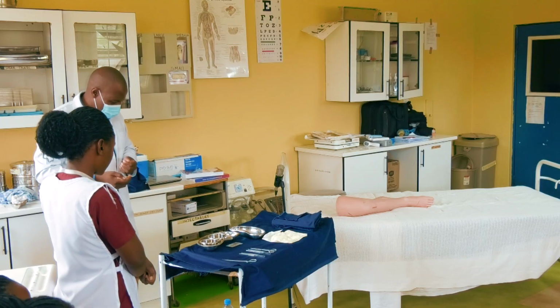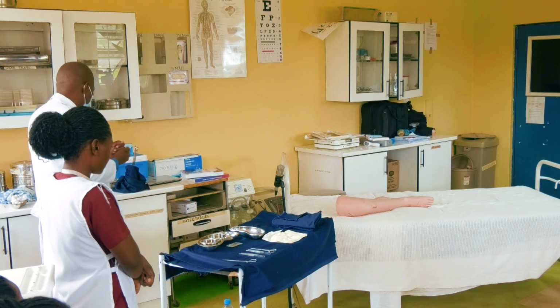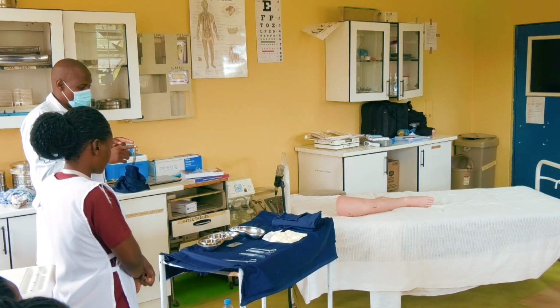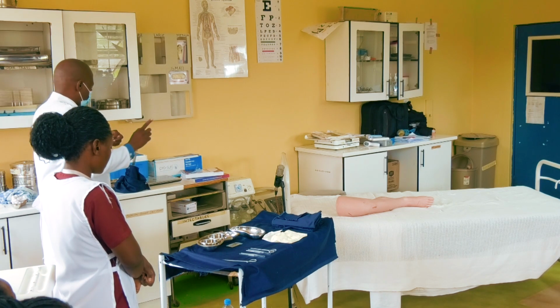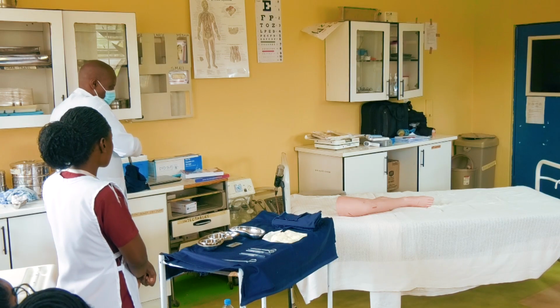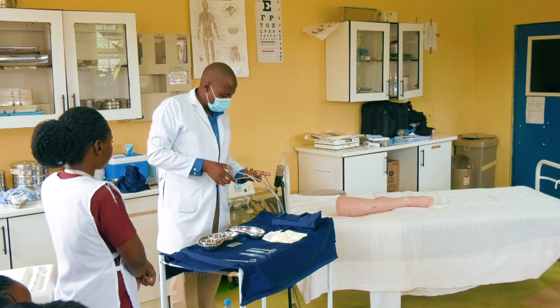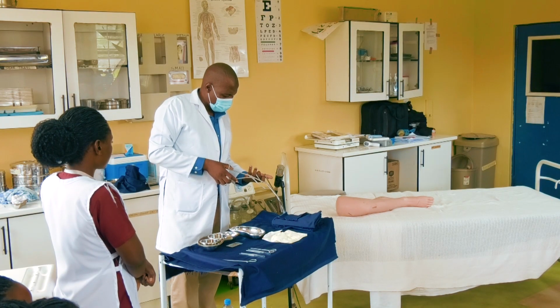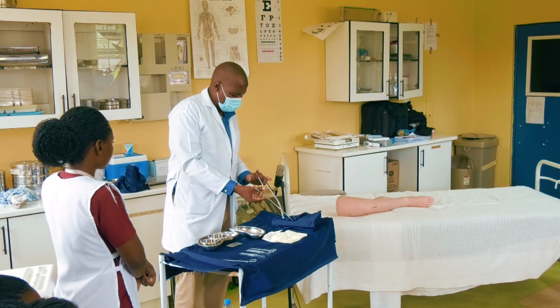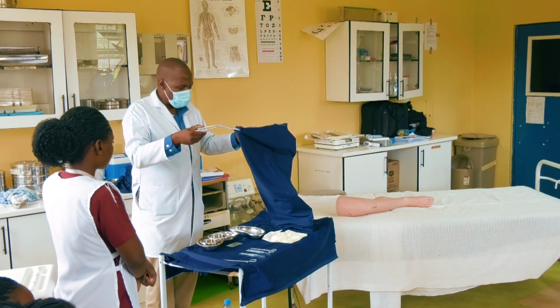Okay, so I think I've got almost everything that I require here. So I need to cover this. Even if you are supposed to do this after you go to the patient, tell the patient that you are going to prepare, or you can do it either way. Let's prepare, then we'll go to the patient. Remember the way we did with this drape. So it's the drape, now we need to cover our equipment.